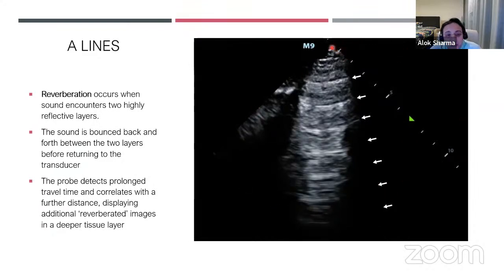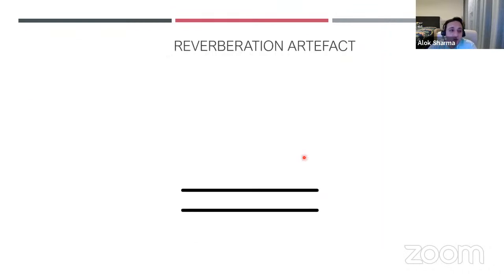And I suspect the reason for that is, I mean, this is 9, so the frequency is on the lower side. Because there's less attenuation, you can actually see the deeper areas of the lung really, really nicely. But from my perspective, what you're classically seeing here is pleura with classical A-line appearance. This is normal. These are because of horizontal reverberation.